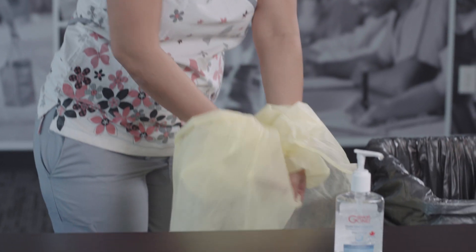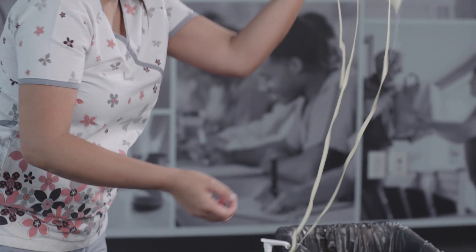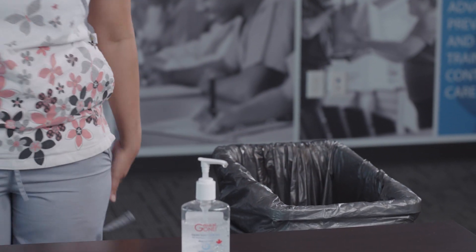Holding it away from your body, roll the gown into a bundle. Place in the garbage bin or, if it is a reusable gown, put it into the soiled laundry hamper.